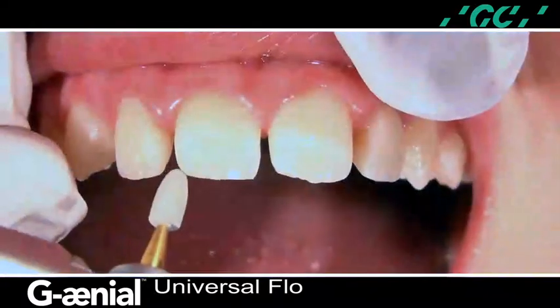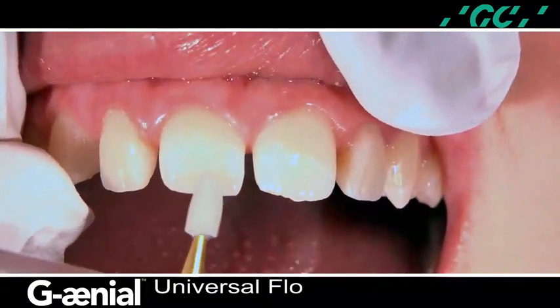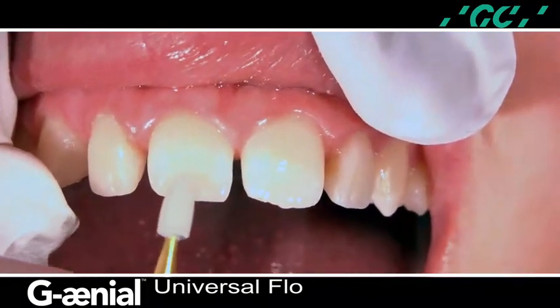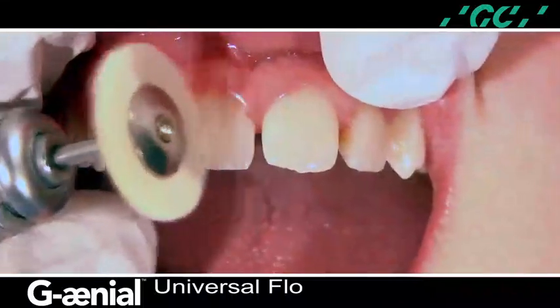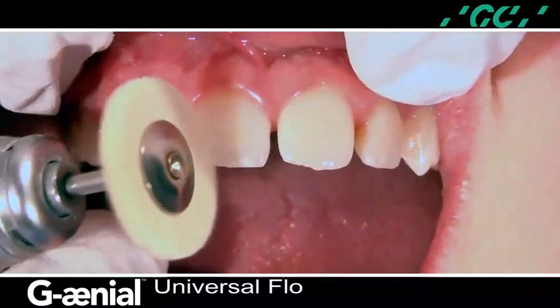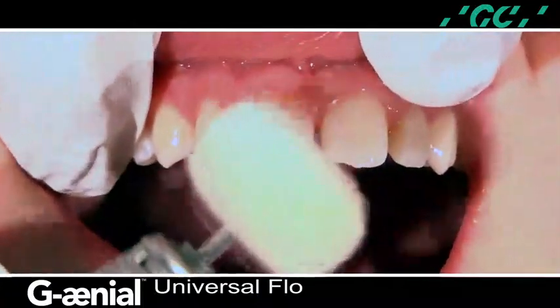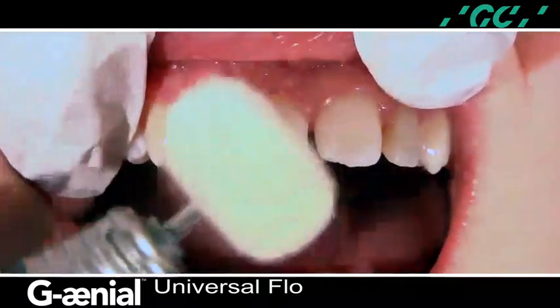The initial polish of the incisal and facial surfaces is accomplished with a high-shine silicone point using the high-luster polishing system. The definitive polish and surface reflectivity is accomplished with diamond polishing paste and a soft white goat hair brush. The final polishing surface gloss is achieved by using a dry cotton buff with an intermittent staccato motion.